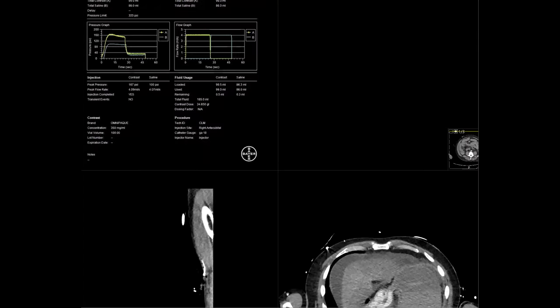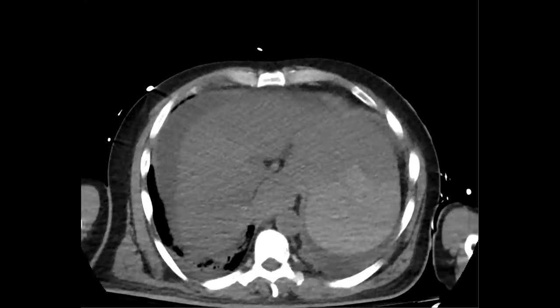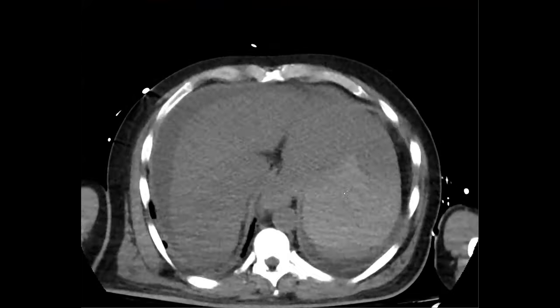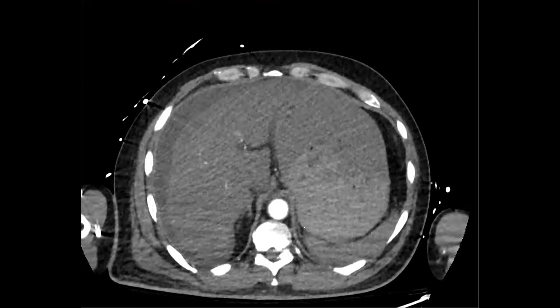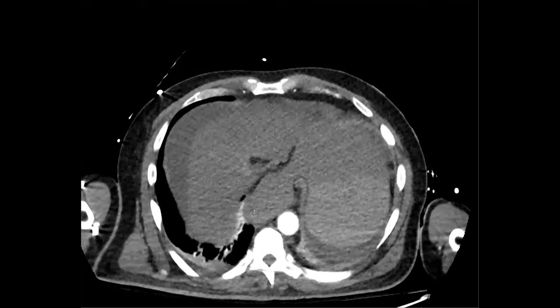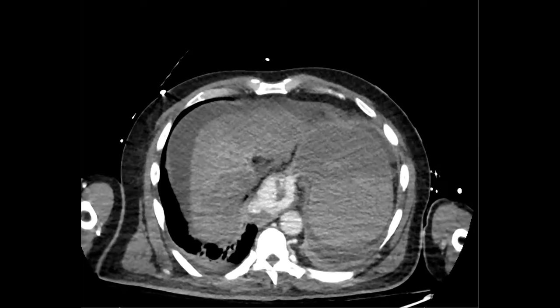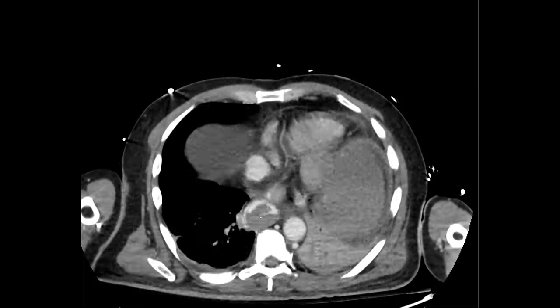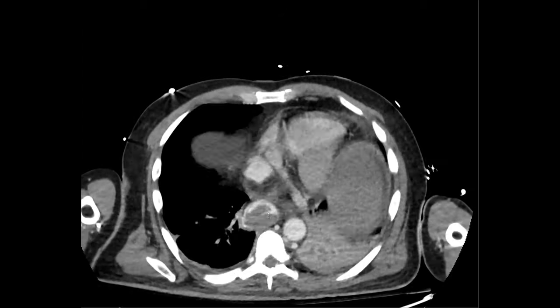This is just a patient who was having GI bleeding. And you can see that there's a lot of hyperdensity in their stomach. And then this was the arterial phase. And I'll just point out that we don't really see any active extravasation in this enlarged esophagus or within the stomach. And then this was the delayed phase. You can see that there's a huge GI bleed. So this patient had cirrhosis, they had esophageal varices, and they had this slow bleed.